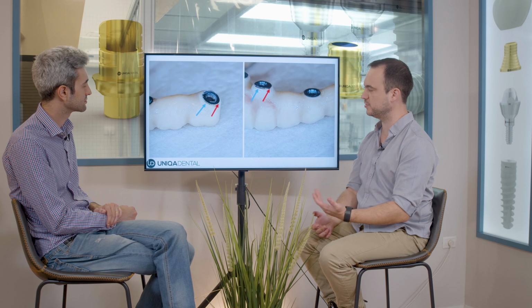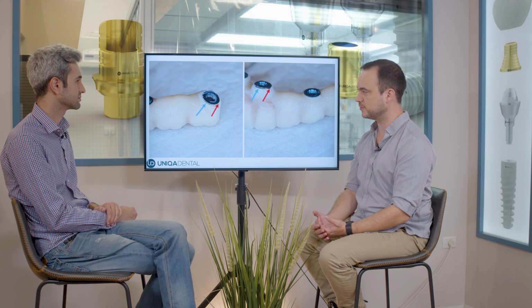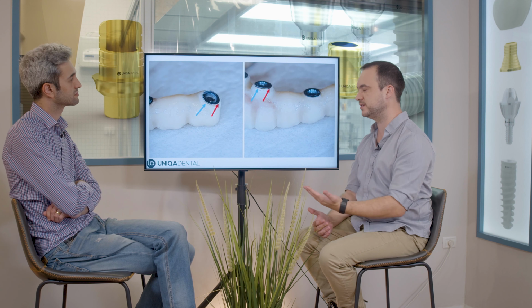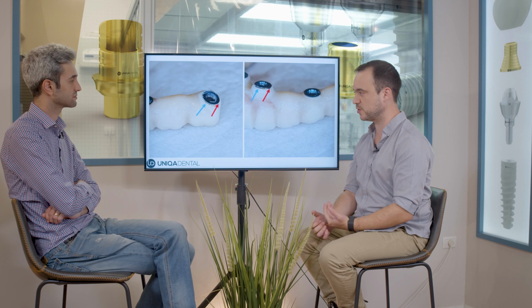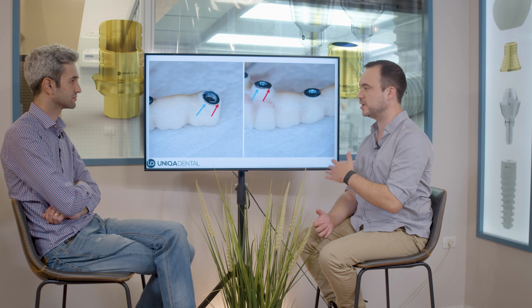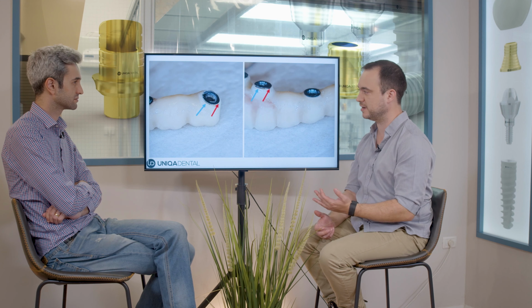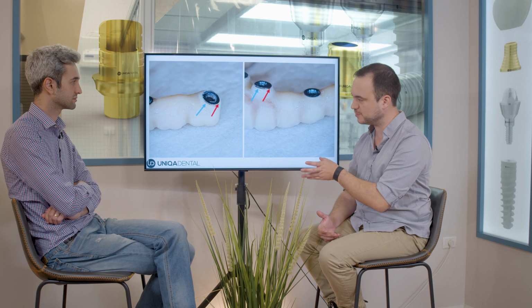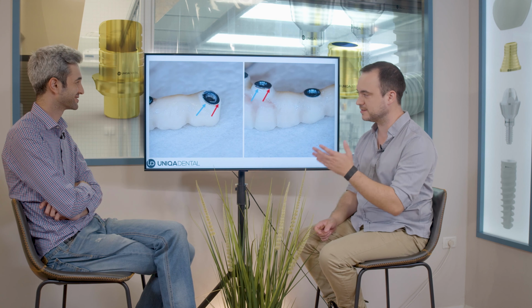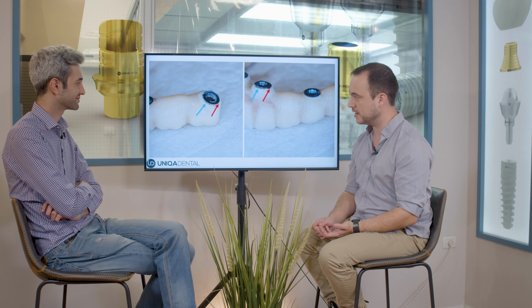You can see in the posterior parts that the gap is not very small. In this case, if you wanted to make a zirconia bridge and then attach it to the multi-unit, you'd have a problem. It's not a large deviation, because it's in magnification. It's like 0.1 millimeters or 0.2.